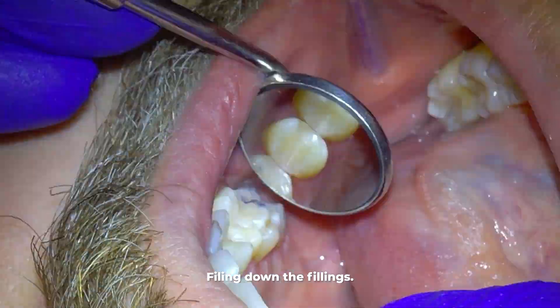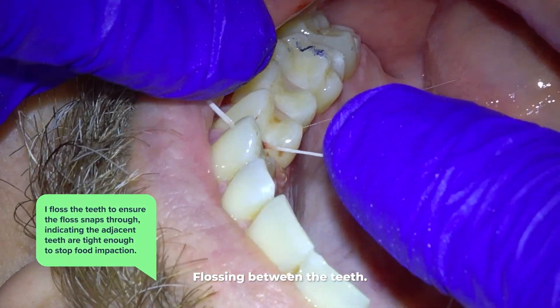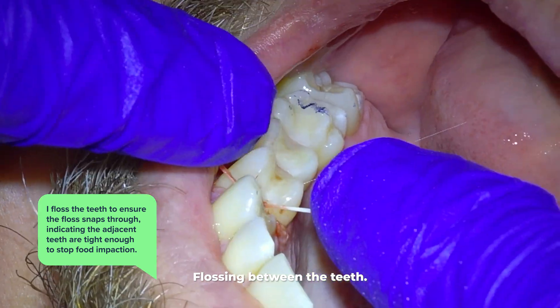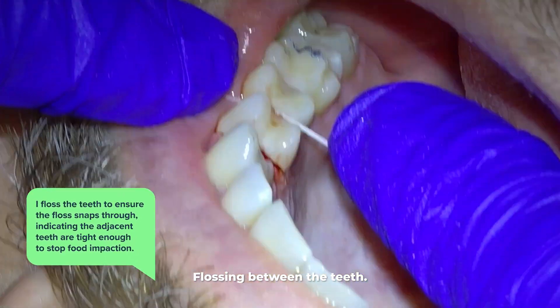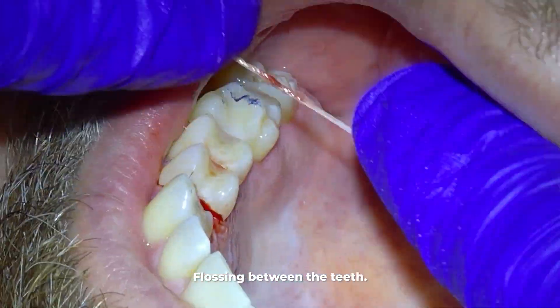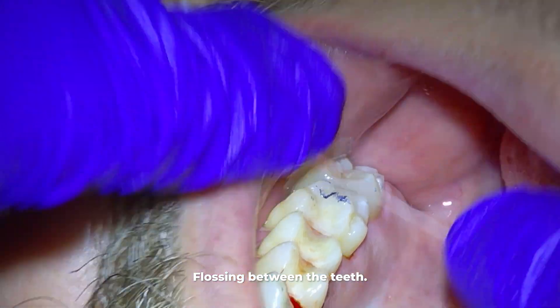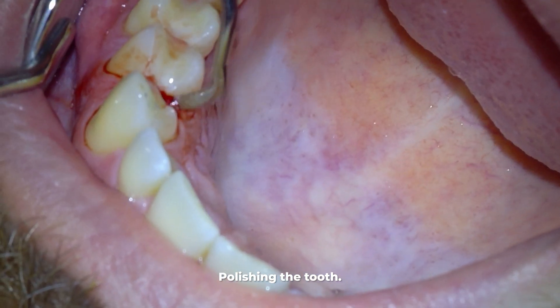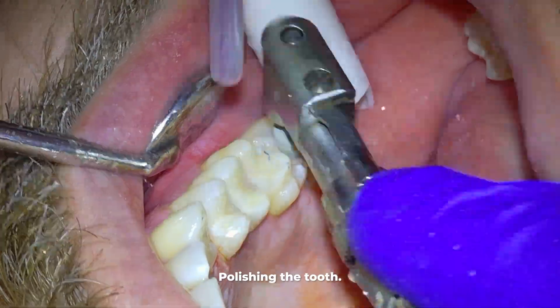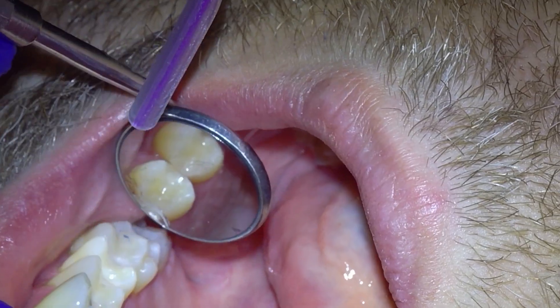One more important check: we floss the teeth to ensure the floss snaps through, indicating that the adjacent teeth are tight enough to stop food impaction. We also check that the floss isn't shredding so you can floss the teeth well. Once that's done, we smooth everything until the floss snaps nicely, then polish the tooth — and voila, you've got a cavity-free tooth with the filling.